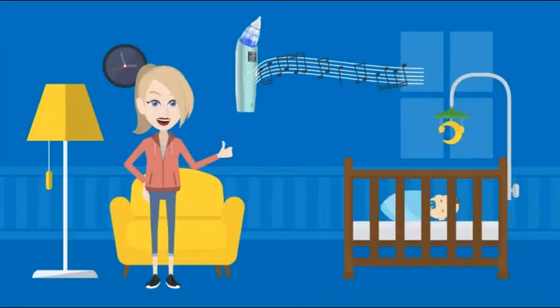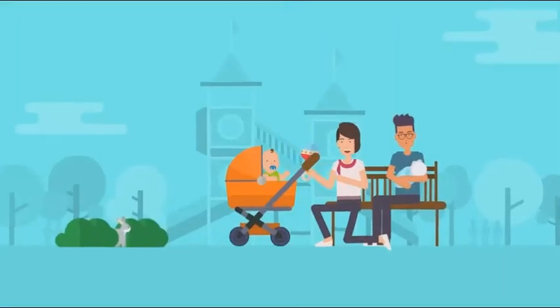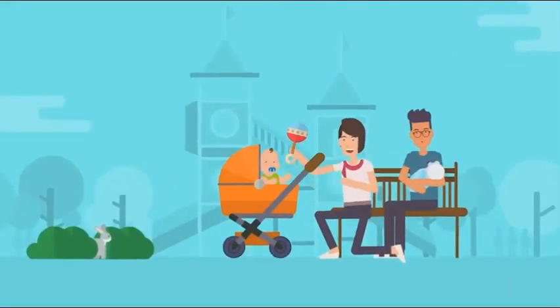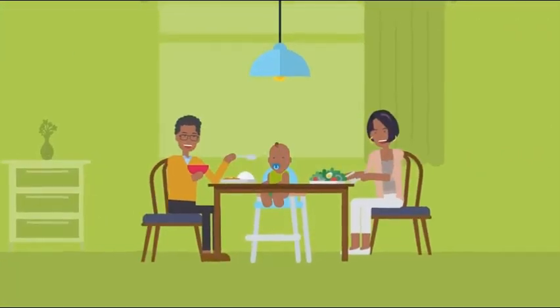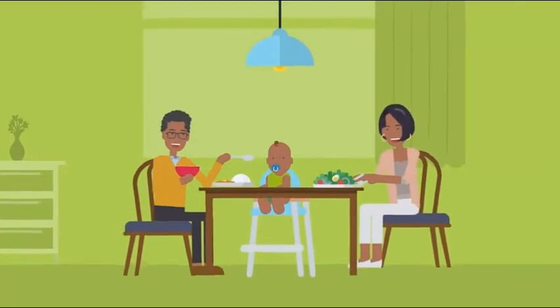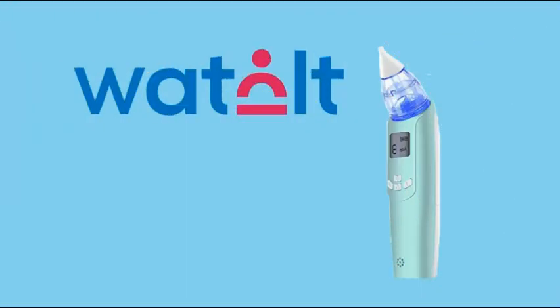You can choose from three settings to increase power and gently suck up sticky mucus. You can also press a button to play lovely music and help your baby relax. As fellow parents, we strive to make life easier for families worldwide. Our Watalt nasal aspirator is designed to make life easy and hassle-free for you and your precious darling. Get yours today with just one click.